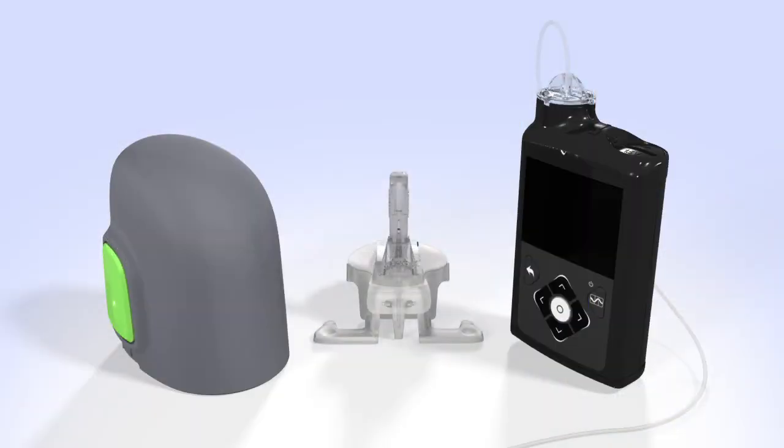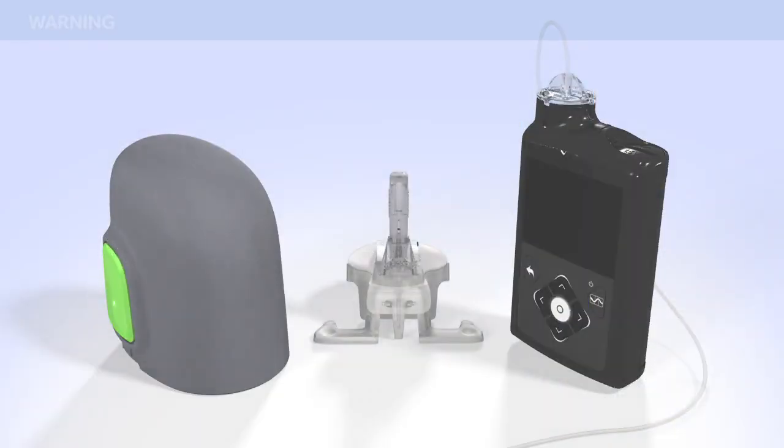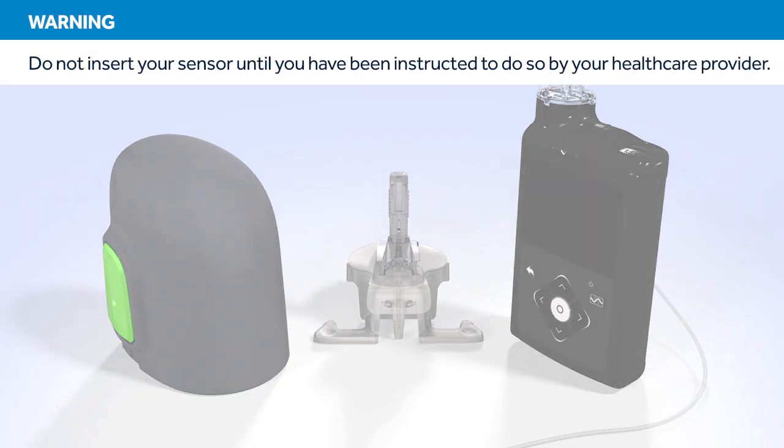In this course, we will show you how to insert a Guardian Sensor 3. Do not insert your sensor until you have been instructed to do so by your health care provider.